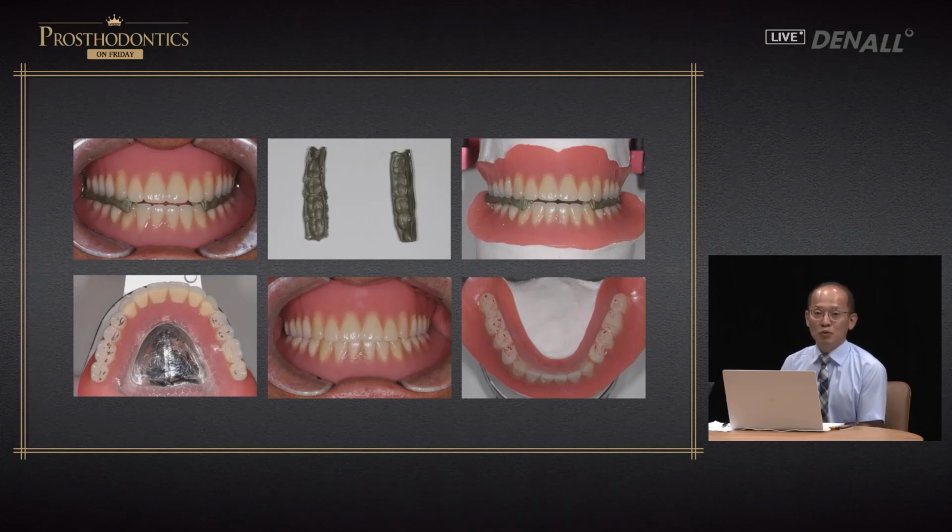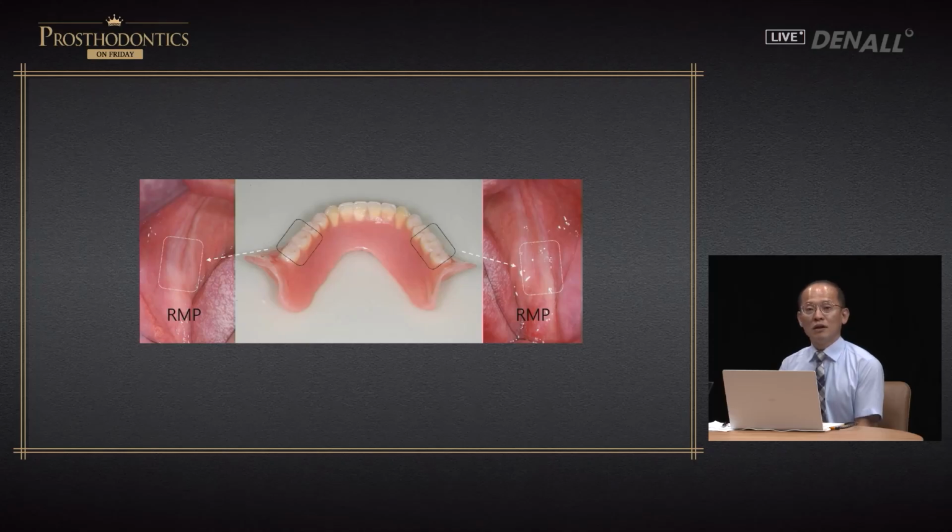And as I said before, as you would sort of guess, per tooth, it's not an ideal contact mark. So in the articulator, it's key to have synchronicity. The midline is a bit twisted, as you can see on the top right side. But on the posterior side, there is always at least one mark per tooth. And with that, as you can see, ultimately where there is a force, it's always on the posterior side.